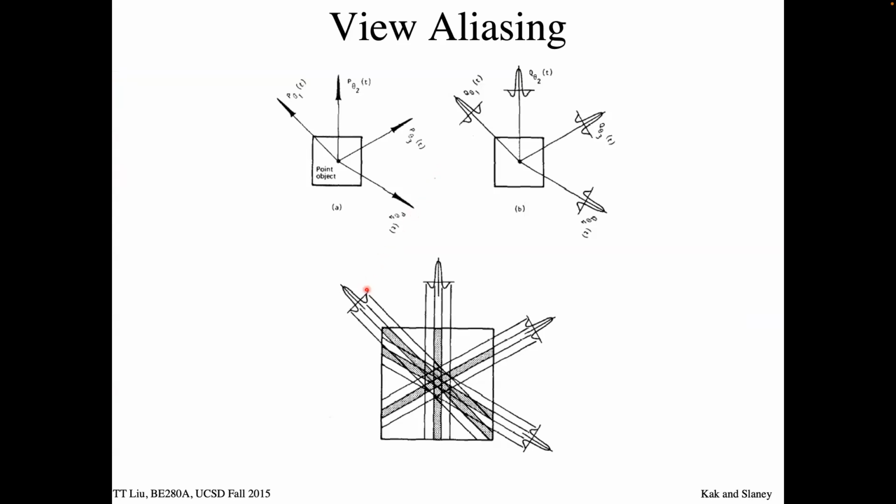And if we have a point here and we take our raw data projections like this, and then we convolve those projections with the inverse Fourier transform of the ramp function, right? So I convolve these and I get these things, and I back project these four.